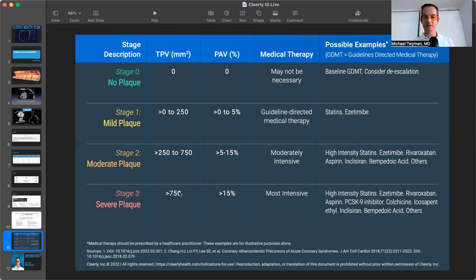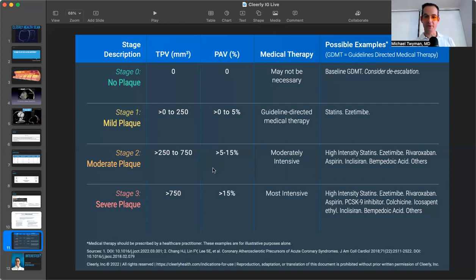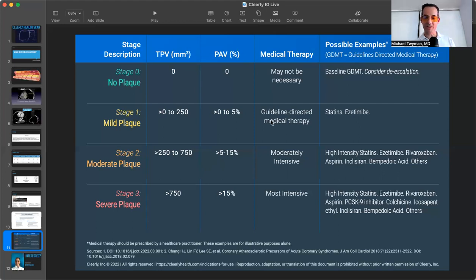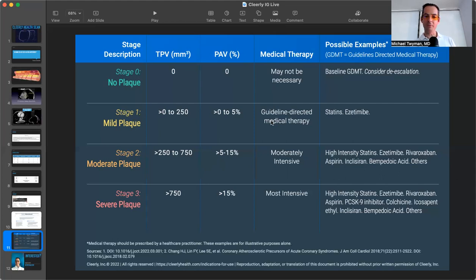The radiologist who reads the baseline images at the imaging center that you go to often will read the report is completely normal. There are no plaques in the arteries. That's what happened to this individual. But when they use the AI machine learning algorithm from Cleerly, they're slicing it voxel by voxel. They will see the plaque at exquisite detail. So even though this was read as a normal CT angiogram, there is some mild plaque building up in this.